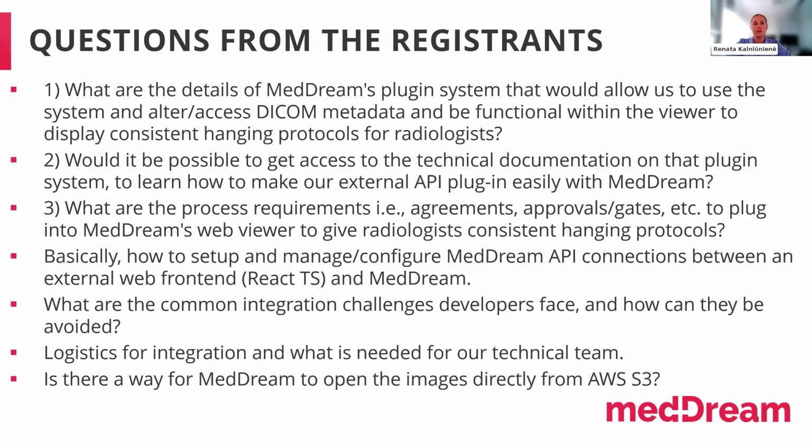Okay, thank you. Another question, logistics for integration and what is needed for our technical team. Yes, so in principle, our MedDream Viewer is available for download. You just go to our website and download the MedDream Viewer. You can even download the PACS Lite version with pre-installed PACS, and just open our documentation and demo documentation and go through the steps, and you will have this up and running.